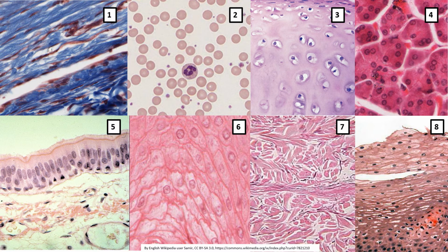Okay, so again, the primary thing we're looking for that's going to help distinguish a connective tissue from some other type of tissue is the distance between the cells and the amount of ECM that we see in an image. We'll also look for the presence of protein fibers.